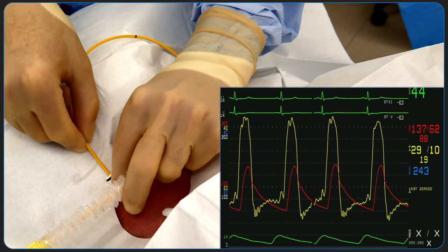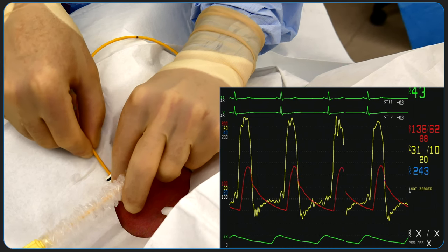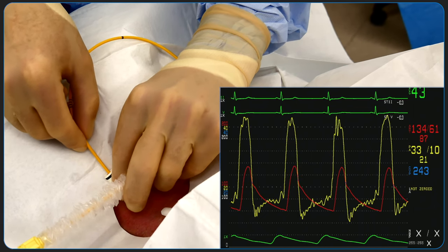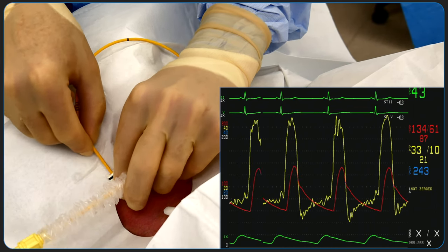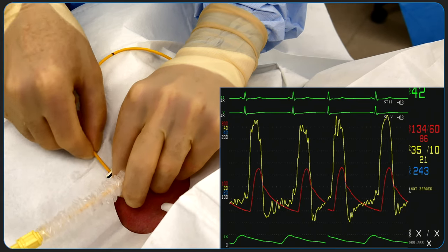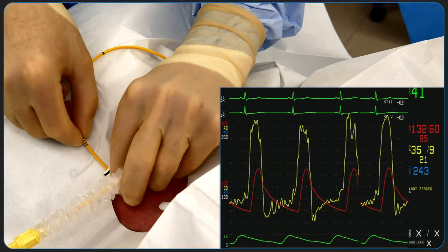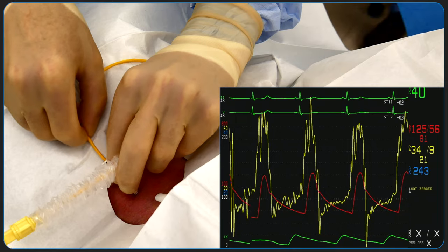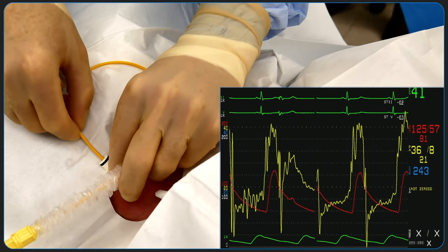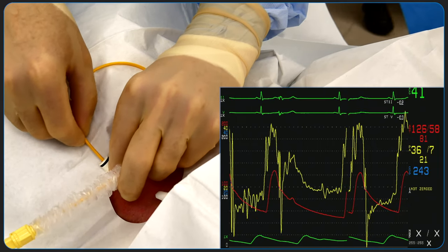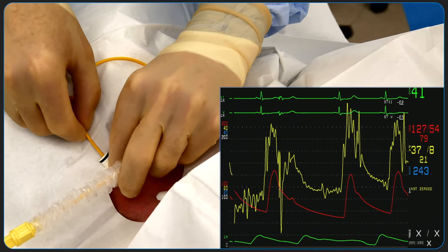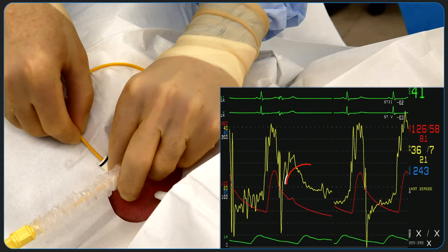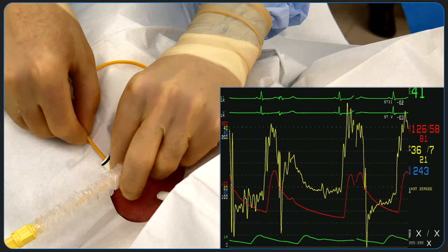A right ventricular waveform with a steep systolic slope is seen and the right ventricular pressures are measured. As the catheter is advanced further, an increase in diastolic pressure is seen, known as the diastolic step-up, which suggests that the catheter is in the pulmonary artery. A distinct feature of the PA tracing is a downslope in the pressure tracing during diastole.